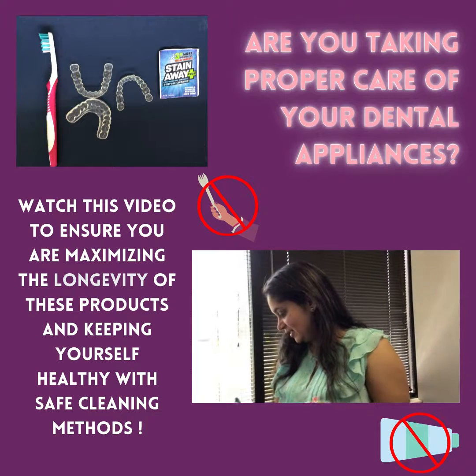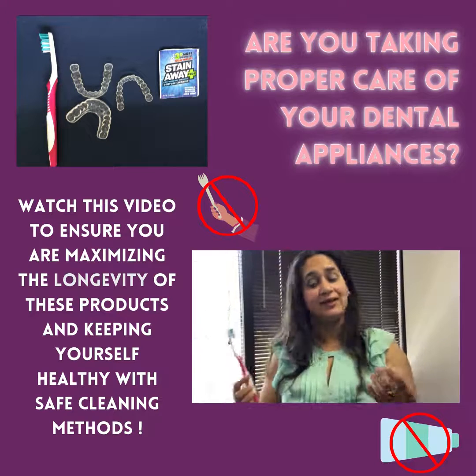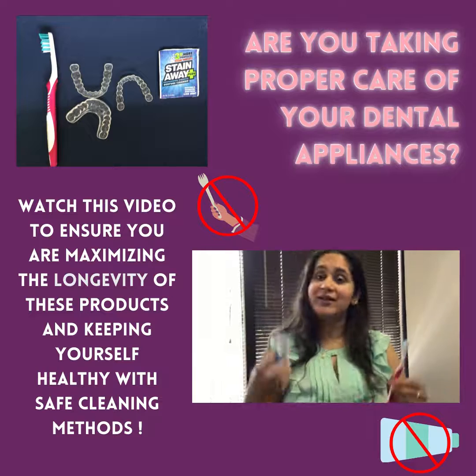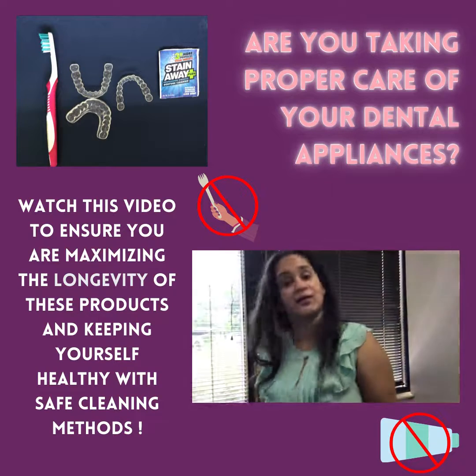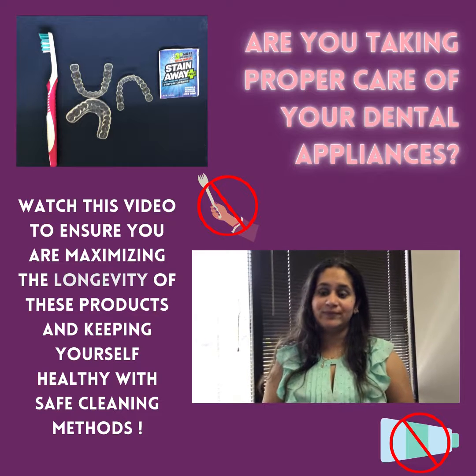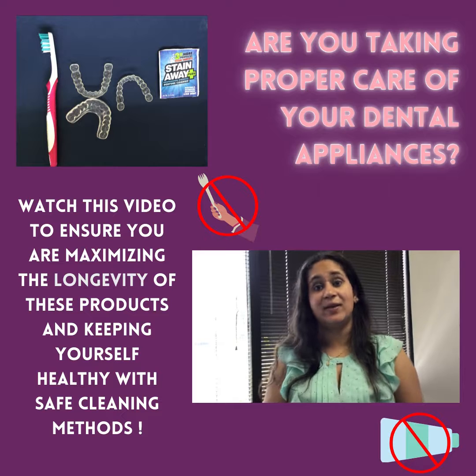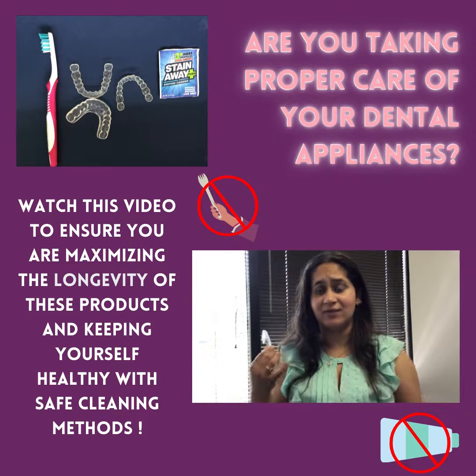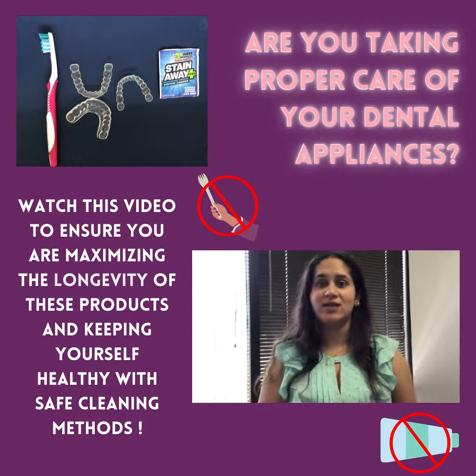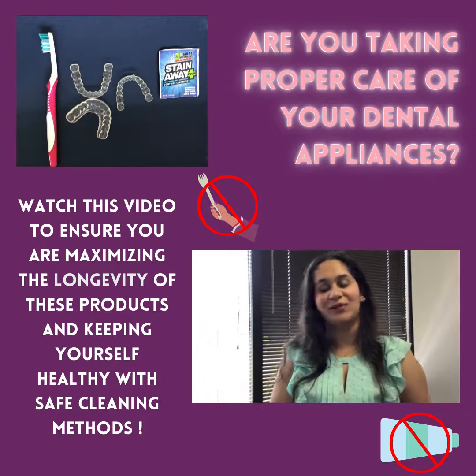So these are the things you need for cleaning: a little bowl, some warm water, denture cleaner, and a toothbrush. I hope this video is useful for all of you to help maintain your oral appliances and get the best hygiene and longevity out of them. If you have any questions, please don't hesitate to ask in the comments and we'll do our best to answer. Have a good rest of your day!